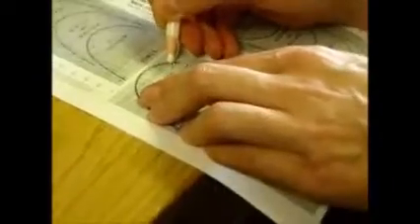So I usually put the third order bend in first. I don't know, is that a bit too far to do it around there? Third order, so that's a bit like torque. Put the torque in, yeah. Now I don't know what pliers you've got to do that. I've got torquing pliers in the bag, or if there's anything. Yeah.